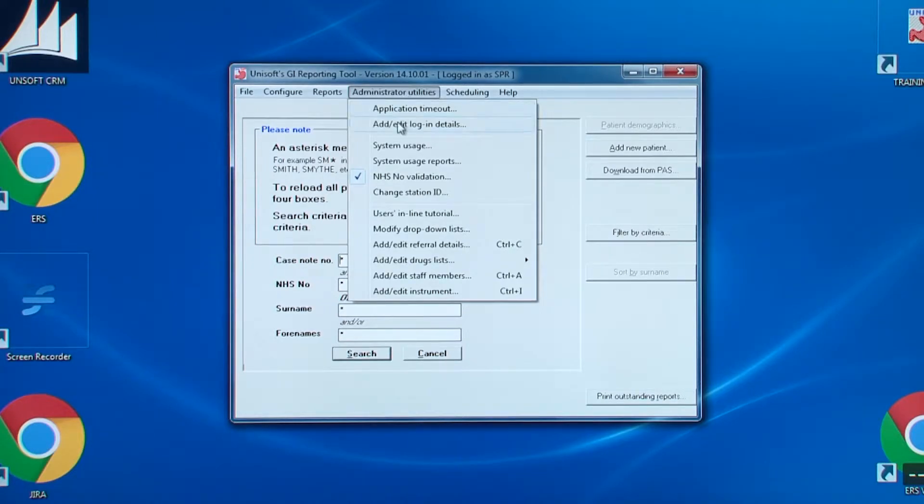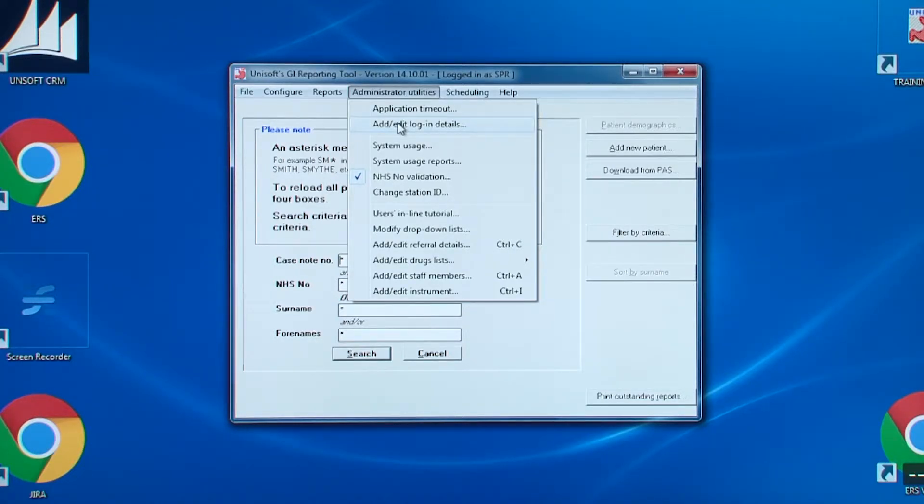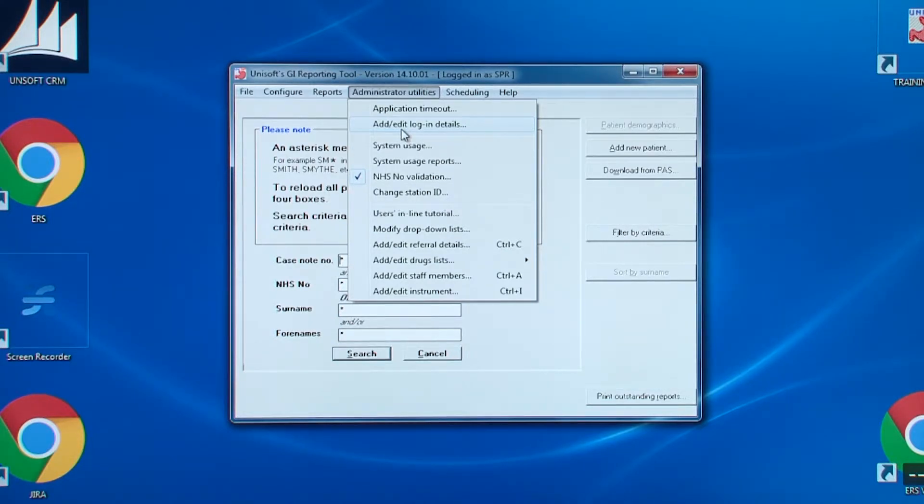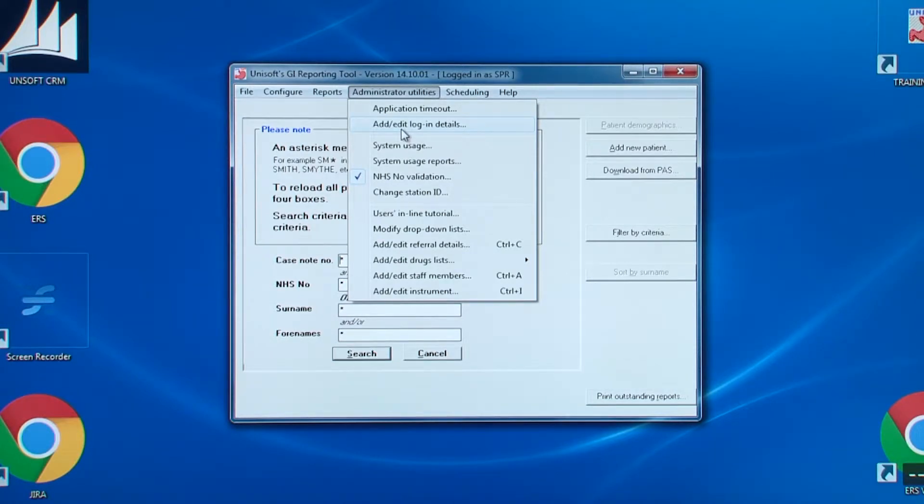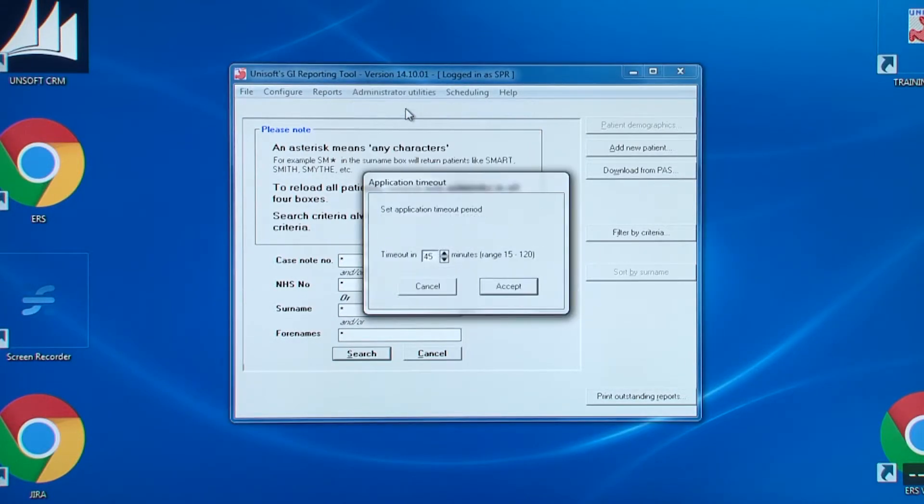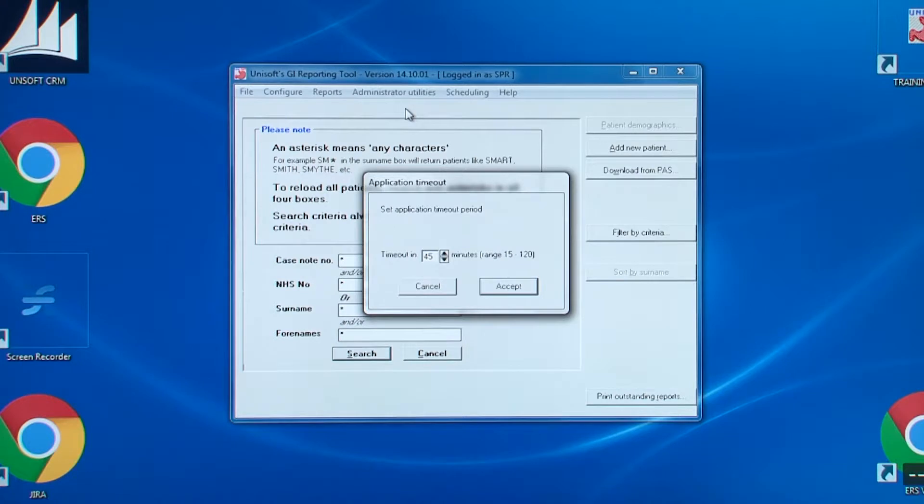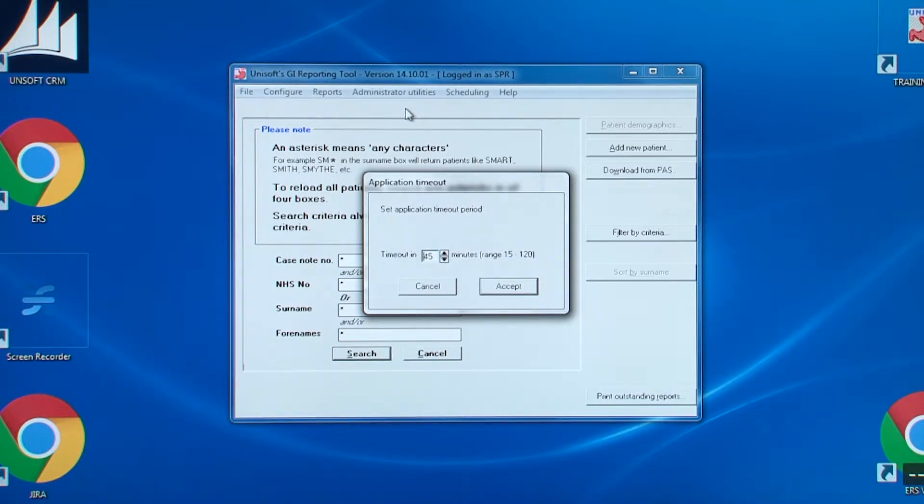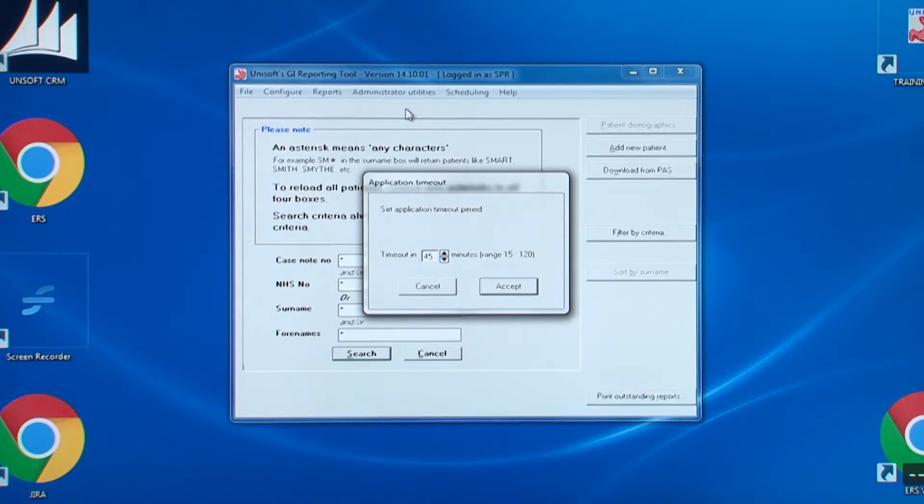These are the entries for the administrator utilities. The first entry allows you to set the software timeout for the particular PC. What this means is that if there has been no activity when the software is left at the opening screen, the software will automatically log that person out. This function comes into play as commonly happens if the endoscopist has not logged out of the software before going to lunch. The software will automatically log the person out. You can see that the default is 45 minutes.